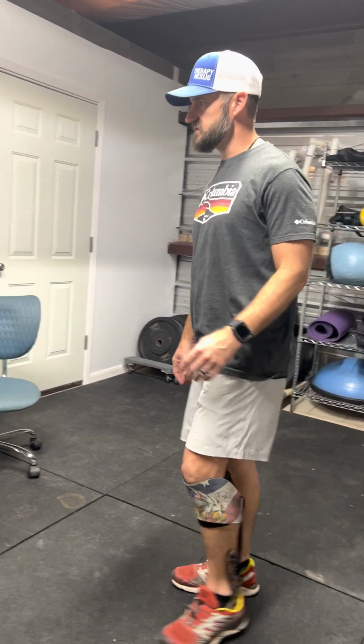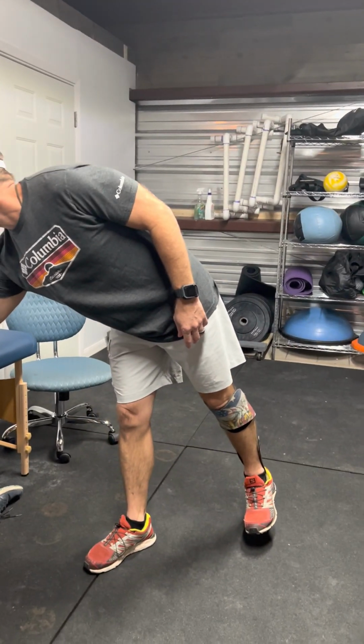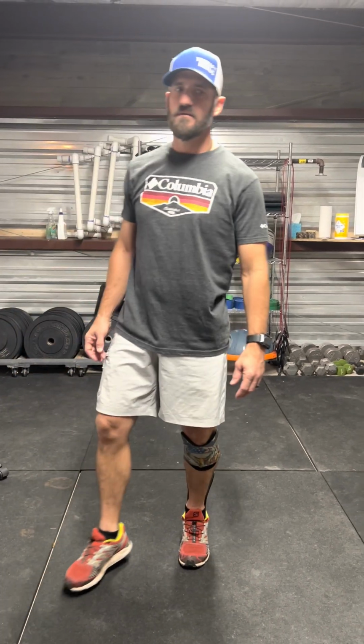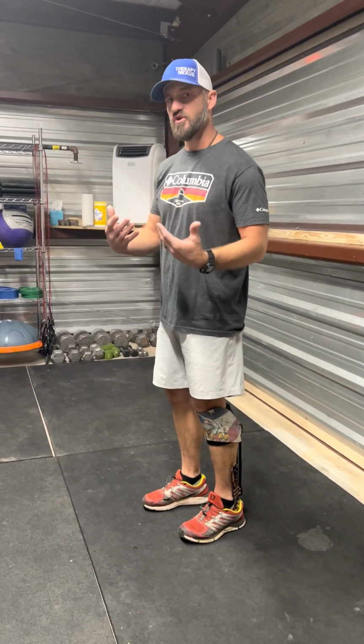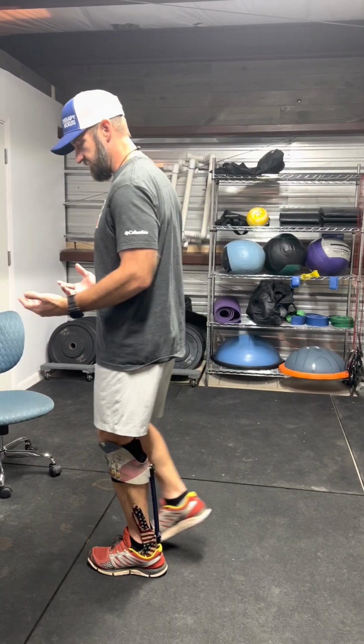All right, next question. Difference between walking and high impact activities. Okay, so like how the brace is going to react and how you're unloaded. So obviously, if you're just bebopping along, this thing is made to be stiff, and my ankle doesn't move hardly at all when I'm walking. So it shouldn't hurt when you're walking. You should be able to unload whenever you're taking that step forward.